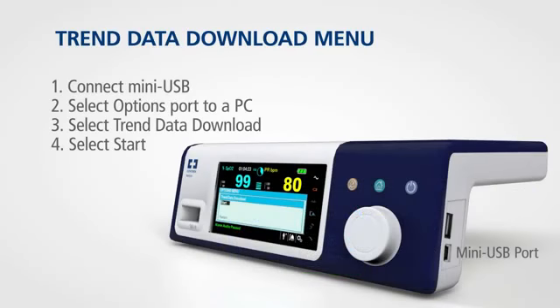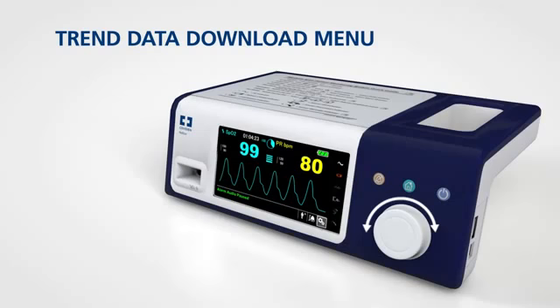You can download your patient's data using the functions in the Trend Data Download menu. To access this menu, rotate the jog dial to highlight the Options menu and press.